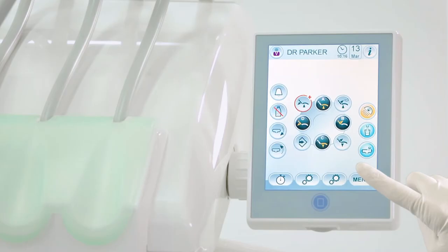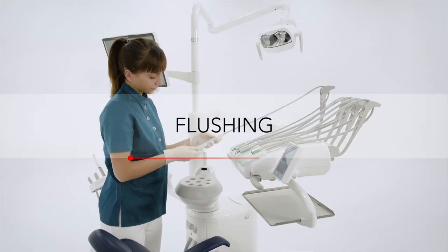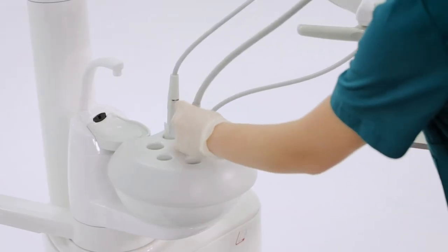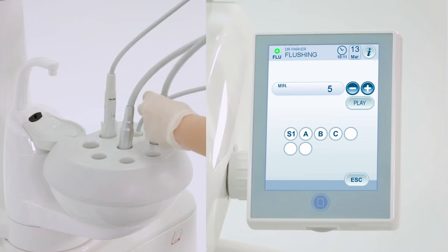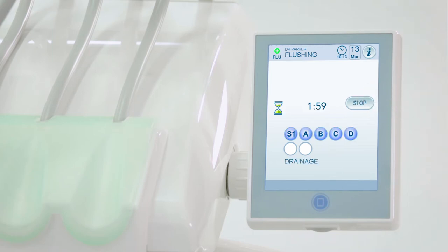From the full touch control panel, the assistant prepares to run the flushing cycle before removing the instruments. The instrument hoses are placed in the special tub provided on the bowl. A personalized running time can be set. Press play to start the cycle.